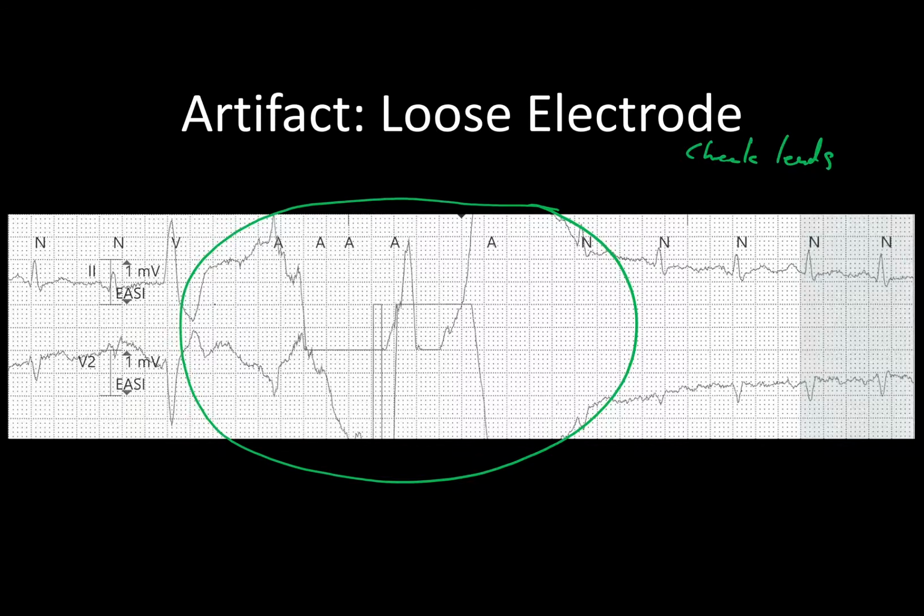And what you're going to be looking at is you're going to check the chest hair, because it may not have been clipped, and so you need to remove that chest hair, replace the lead. Check, replace any leads, if not all of them, to see if that corrects this issue. Check the inside of their gown. Sometimes the lead catches on the gown and the patient's body, so when they move around, it gets really bad, but then you walk in there, they sit still, and it looks fine.